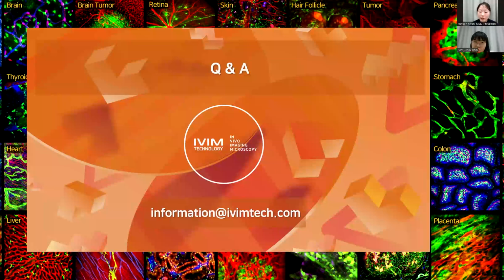In this case, you can acquire the imaging data during 11 days. But you could also utilize the abdominal imaging window. You can implant this ring type of window on the skin, and it will last over 8 to 12 weeks. So you could visualize the kidney for over 2 months.